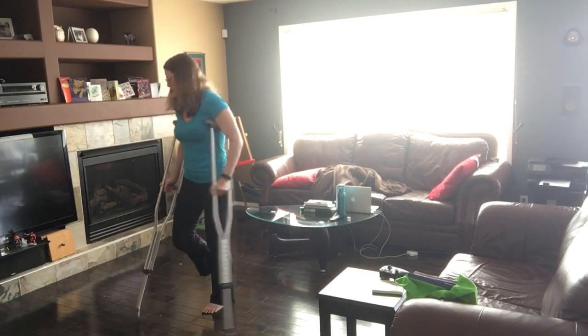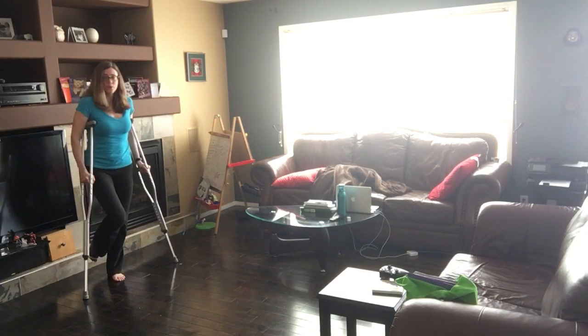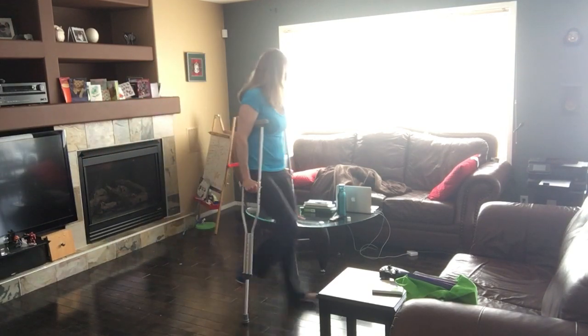Let me go over to the side here and show you how I walk across. See, it's quite maneuverable with crutches. Just walking across — I put the crutches in front and then swing through. That's all there is to it.